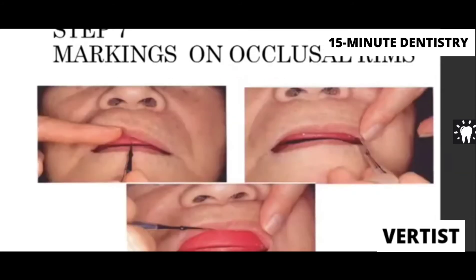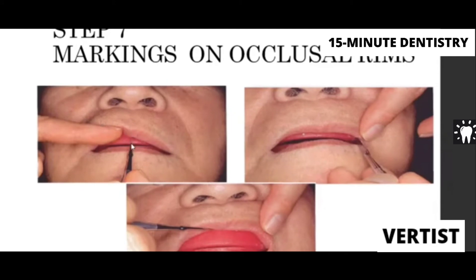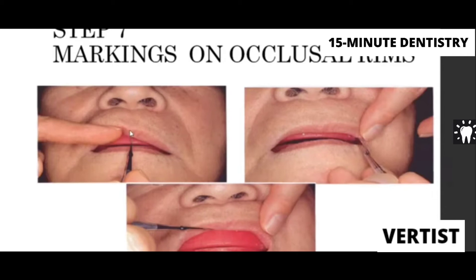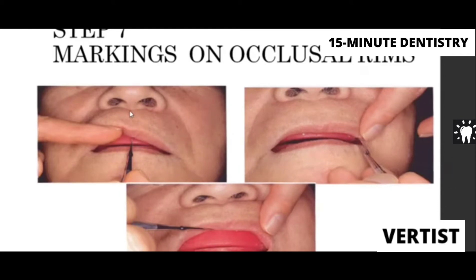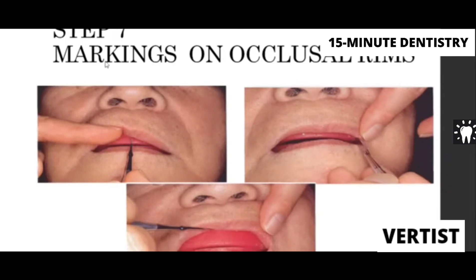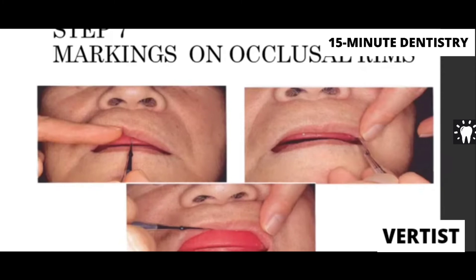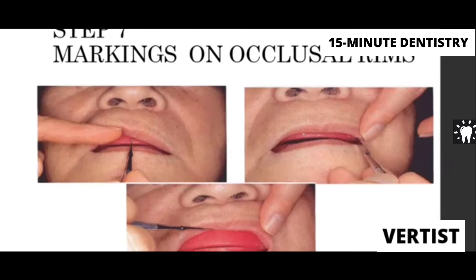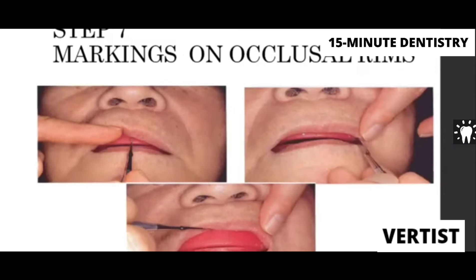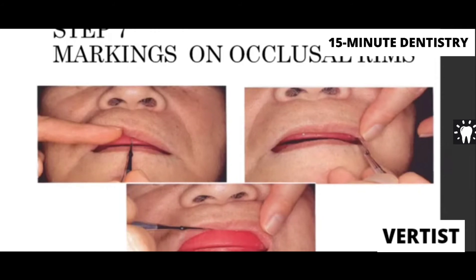Before actually recording the centric relation, you're going to do some markings on the wax rims. The first marking is the midline on the maxillary rim, guided by the midline of the face. You can adapt a thread on the patient's face from the forehead down and make an indentation on the wax rim exactly following the facial midline. Another reliable guideline for marking the midline is the incisive papilla — the center of the incisive papilla and the midline usually coincide.